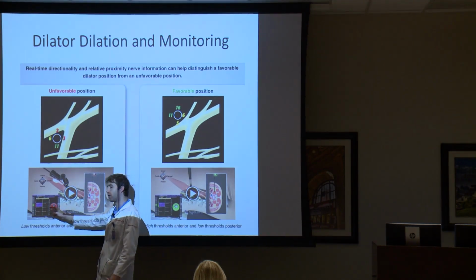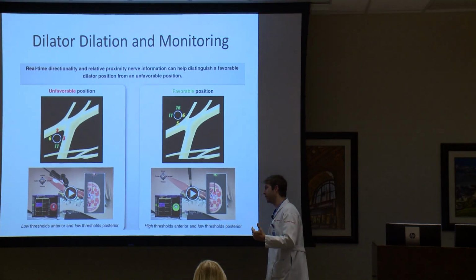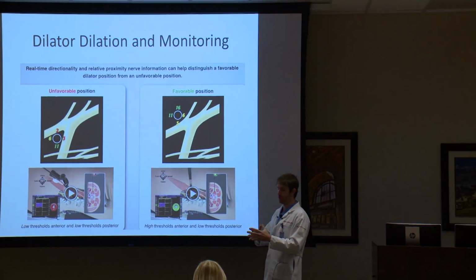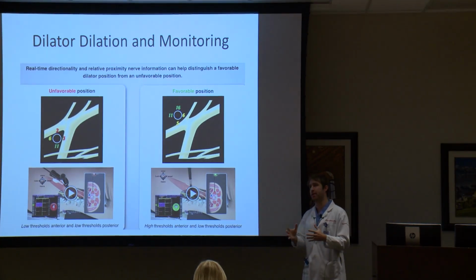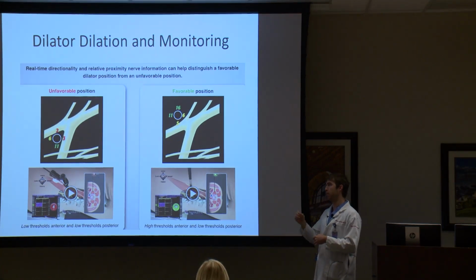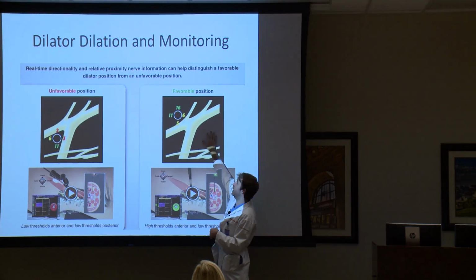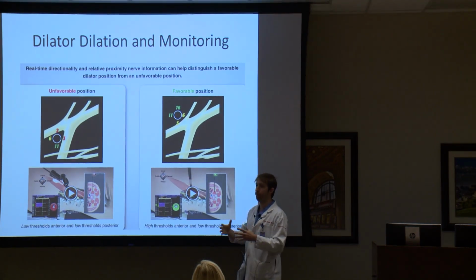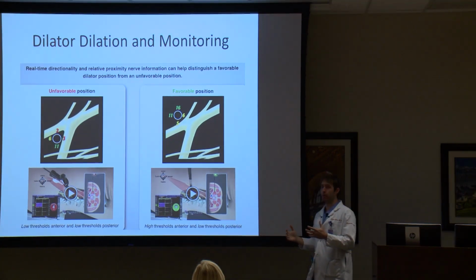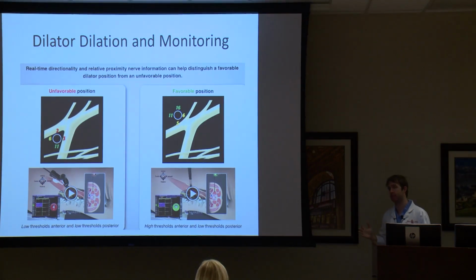And it's usually ringing off the chart in red, or the neuromonitoring people that are in the corner are telling you, no, this is not good, because the threshold is very low, because essentially it sends out an electric pulse or charge, and depending on how long it takes to get a stimulation back, you can see how close you are to a nerve. And so, you want to be in front, or in a safe place there, far enough from those nerves.